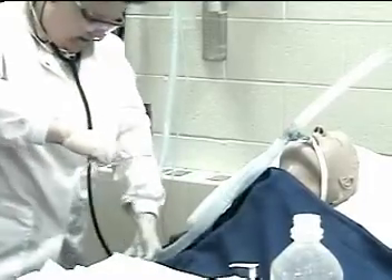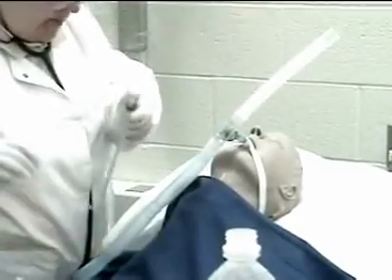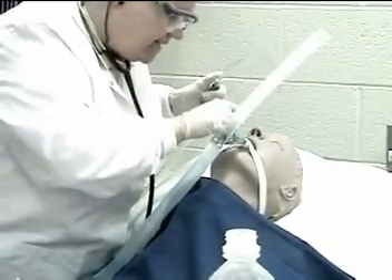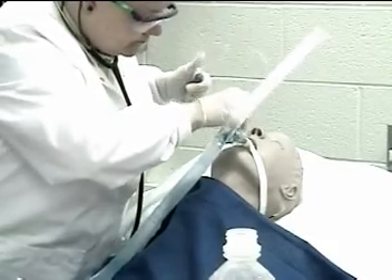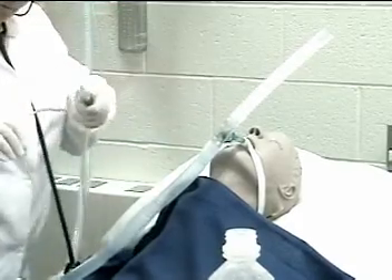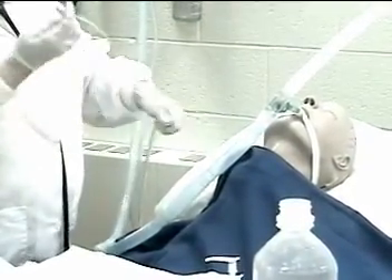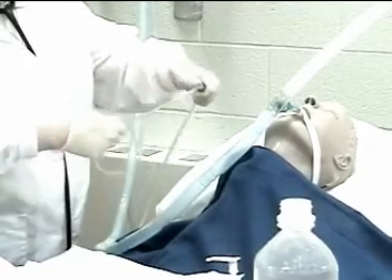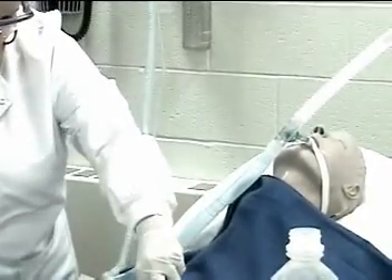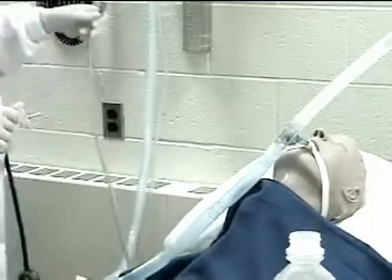So before I go, I want to clean out your mouth a little bit — get some of that mucus that might be in there. Slide this into those little pockets. Suctioning the patient's oropharynx is often beneficial in removing excessive saliva and other secretions. Okay, that's done for a couple minutes. Hopefully I got some of that mucus out for you.